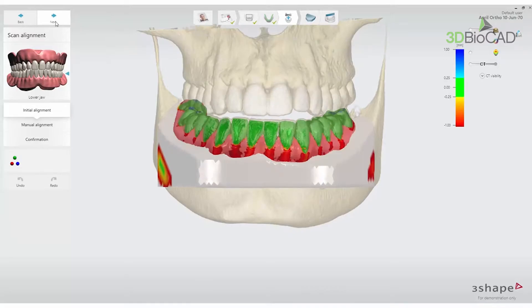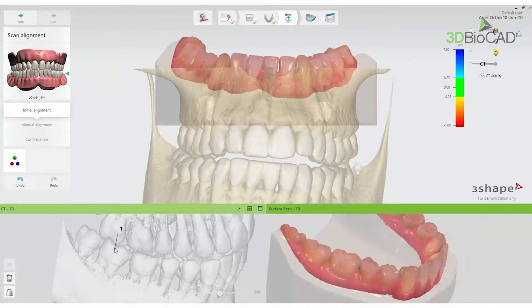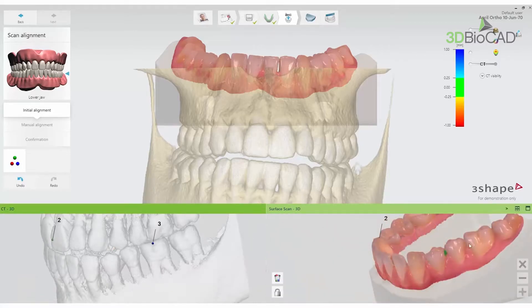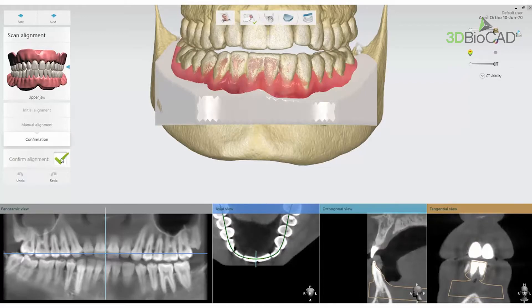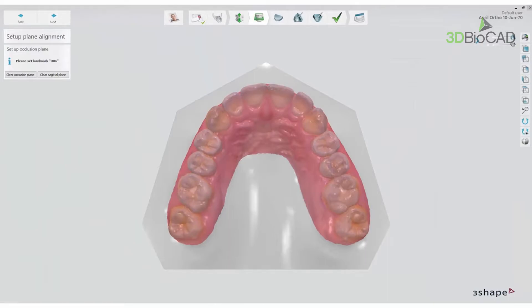Press Next and perform the same procedure for the lower jaw. The patient case will now be aligned in OrthoAnalyser. In this video you have learned how to import CBCT scans and align the CBCT scan with your intraoral scan using the CT Preparation module.